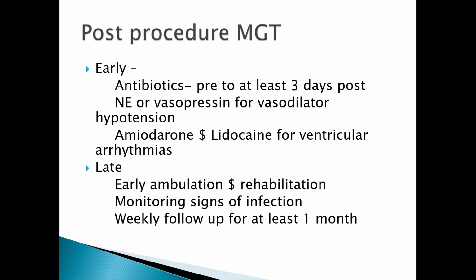Then for late post-procedure management, the patient needs to start ambulating as quickly as possible. You need to monitor this patient for signs of infection, and it's recommended that this patient be followed up weekly for at least 1 month.